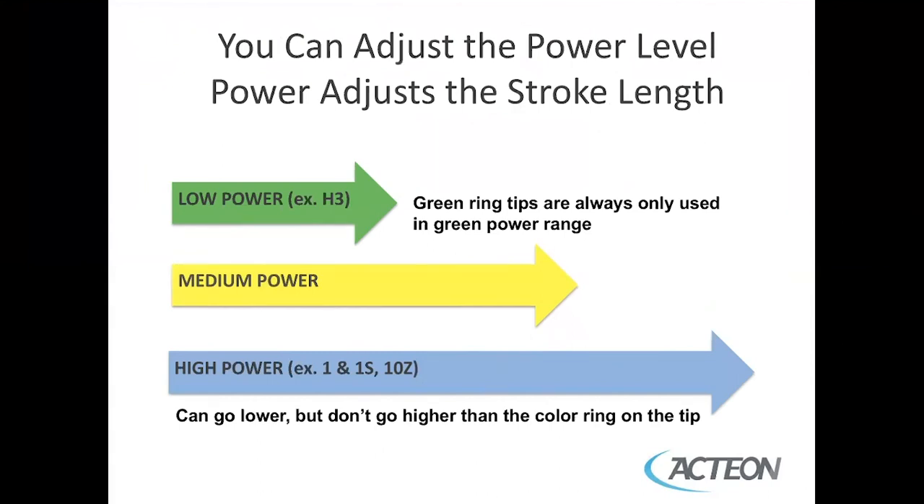The power setting is adjusted using the plus and minus controls. Low power is for your H3 — green ring tips are always only used in the green power range. Medium power is yellow. High power for your number one, number one S, and 10Z is the blue ring. Just remember, you can always go lower if needed.